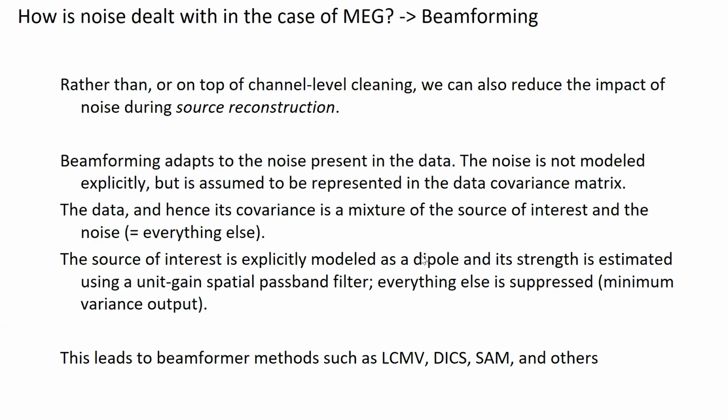So I think still interesting to see is how much do we have to suppress the noise on the channel level, or how much can we rely on source level reconstruction also dealing with the noise. With the CTF system that we have in Nijmegen, actually, we're not using third order gradients because we're using beamforming a lot, and beamforming deals with the noise just as efficiently as the channel level cleaning would.